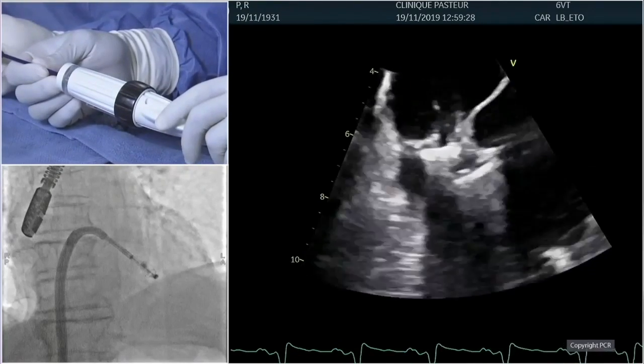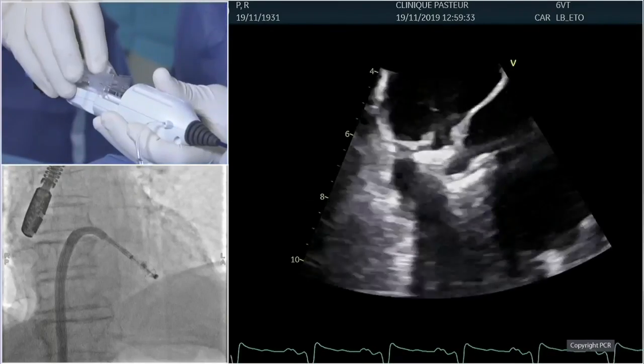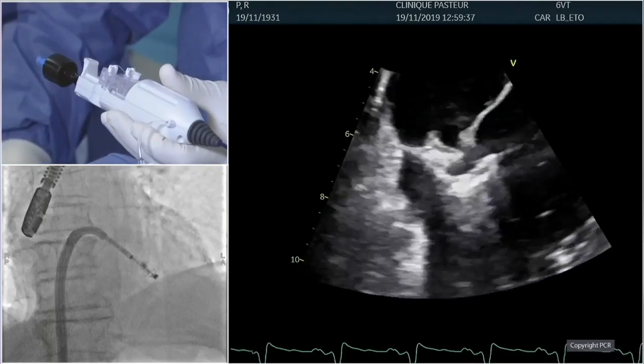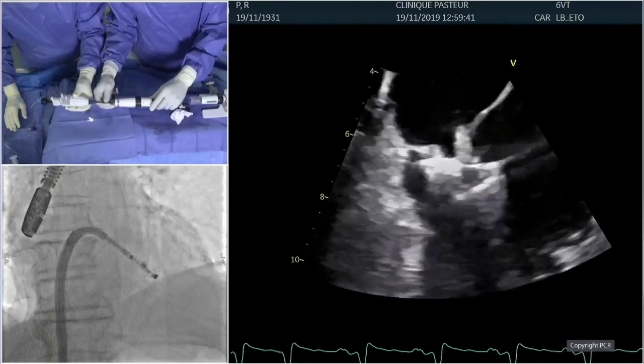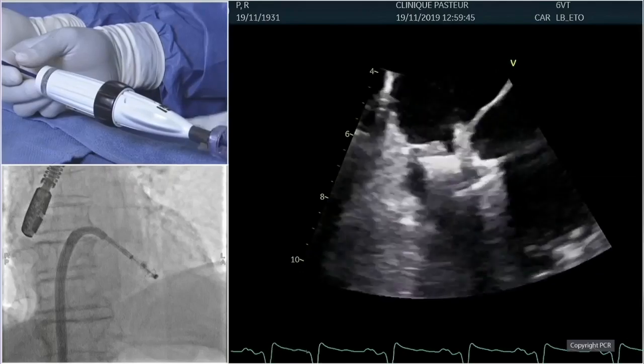What about your experience to close? I'm going to descend the clasp. Yeah, we can do that, but I'm going to descend the clasp now. Okay, so then I'm advancing a little bit, and we're going to search for bouncing. First, we have to look for some bouncing, but it seems that the posterior is out, I think.